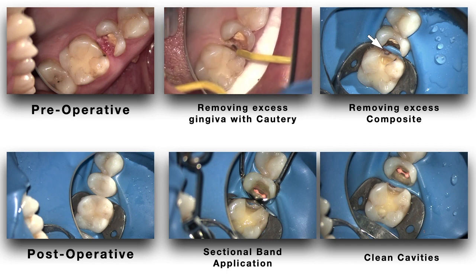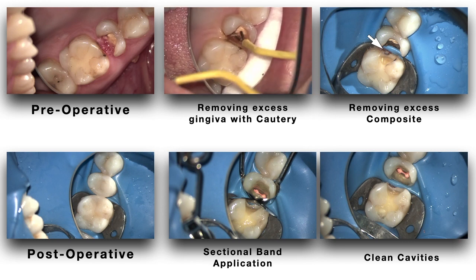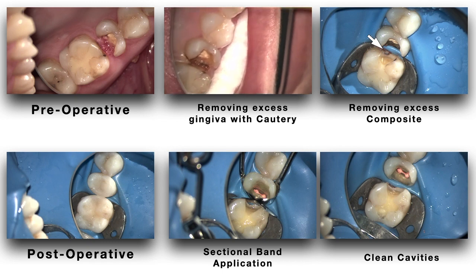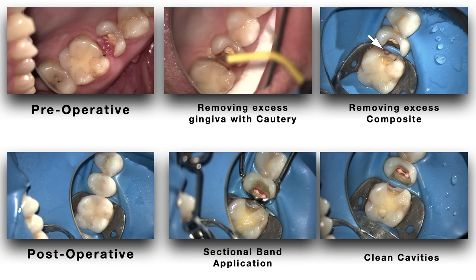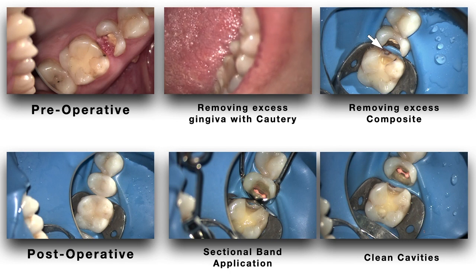So maybe they ask how we can remove this polyp. There are many ways. I can easily say that with the cautery, in only seconds, I am able to clean this area. So I put the rubber dam, and you see it is a very, very nice isolation. Another thing that I see after I remove the composite, I see that they made a ditch, or there is overhang of the composite. I remove it completely, then I do cleaning, root canal therapy, and then I do composite or the final coronal restoration. So in this way, we are able to teach very easily.